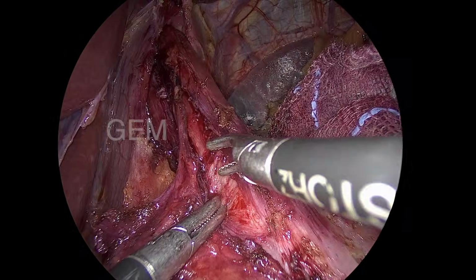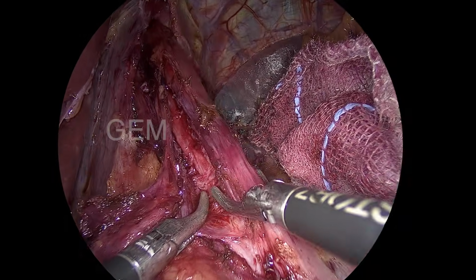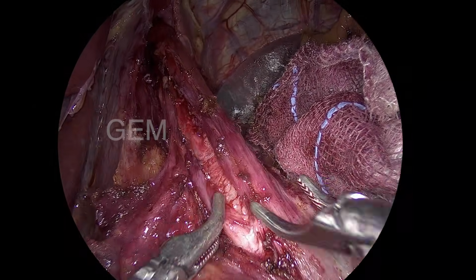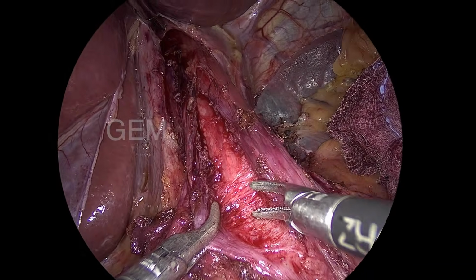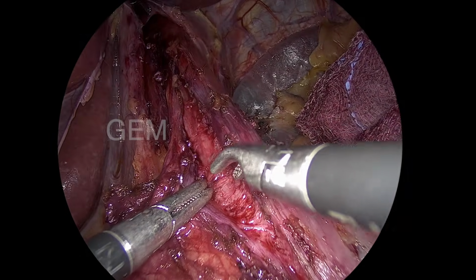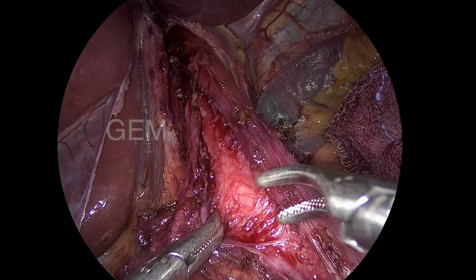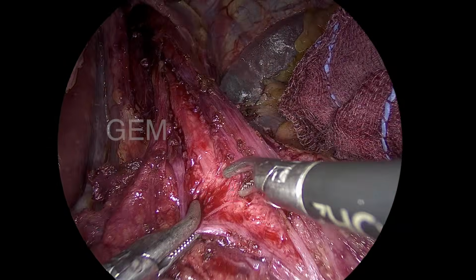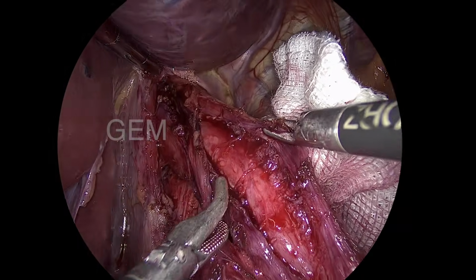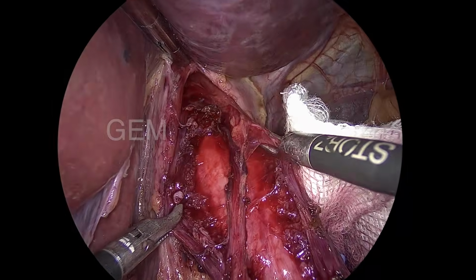So, I am at the OG junction now. That is the OG junction, I am separating. You can see by pulling out the longitudinal muscle, these fibers are getting separated. Since it is obstructed at the OG junction, don't expect a very thick muscle fiber requiring a harmonic or any other energy device to divide. Functionally it has failed to relax. That is why the patient has dysphagia.